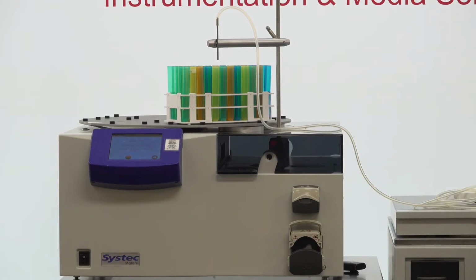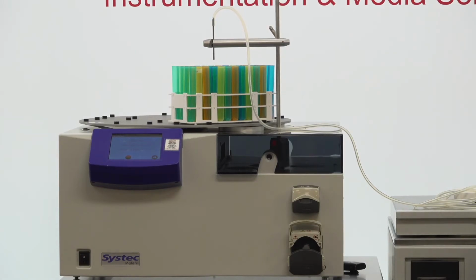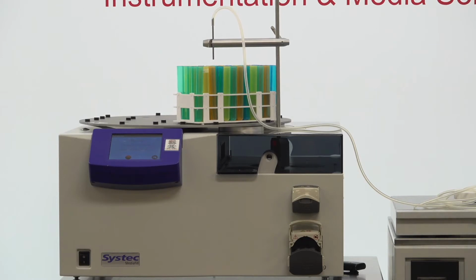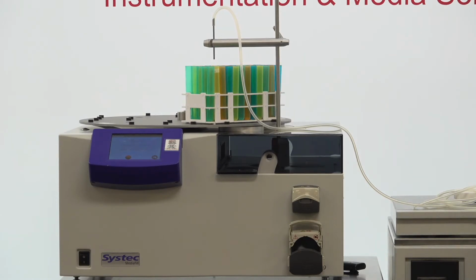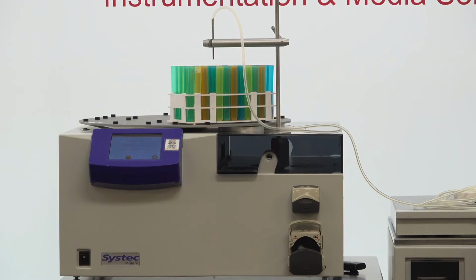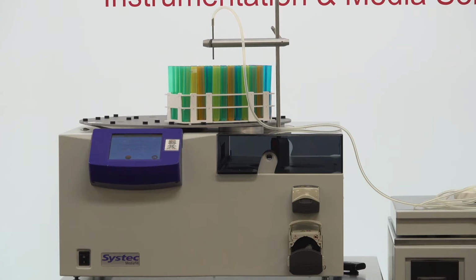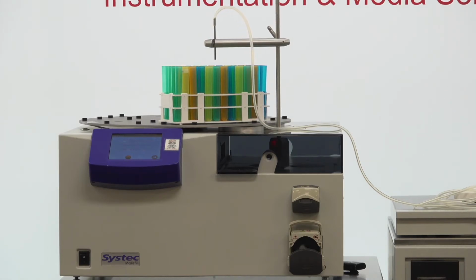The entire rack of tubes, if you're doing a 9 mil fill, which is very common for these 16 millimeter tubes, what we're looking at is about 10 minutes is the time frame that you would be looking at for filling of all 240 tubes. And again, while that's happening, your end user could be doing something else. They don't need to be standing here watching this. They could be capping the tubes that have already been filled or filling more racks to add to the system.